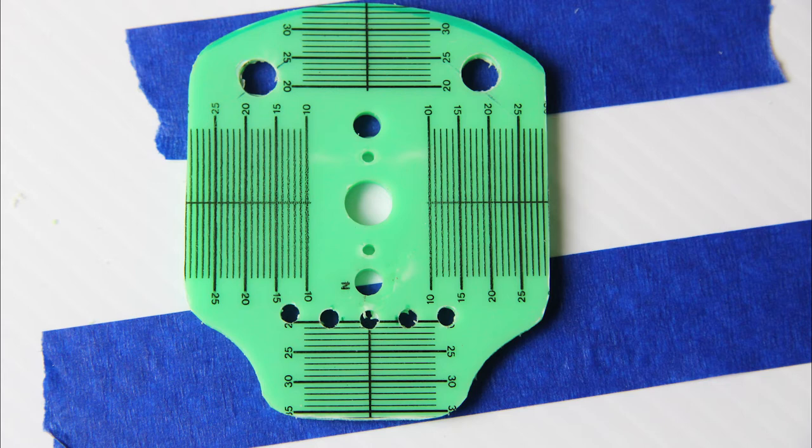And this was, I think, maybe four, maybe five attempts working through this pattern, bringing it back out to the shop, doing some more handstone work, doing some more grinding, filing. And at last, after much trial and error, it was finally ready for the edger.